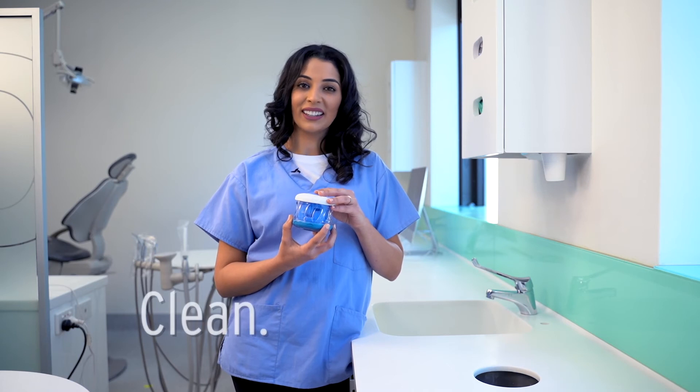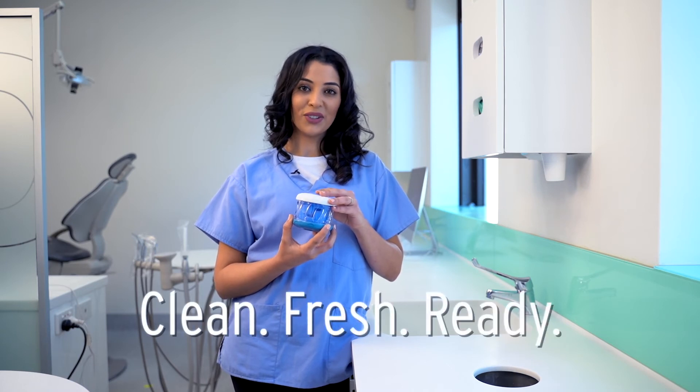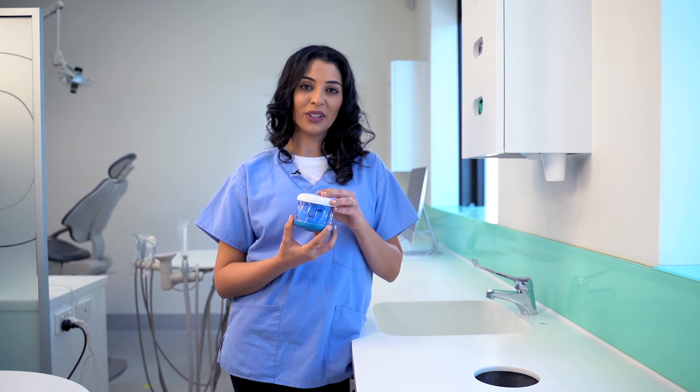Now that your dental appliance is clean, fresh, and ready to use, you can pop it straight back into your mouth or leave it safely stored in your Dr. Mark's Hygiene until you need it next.